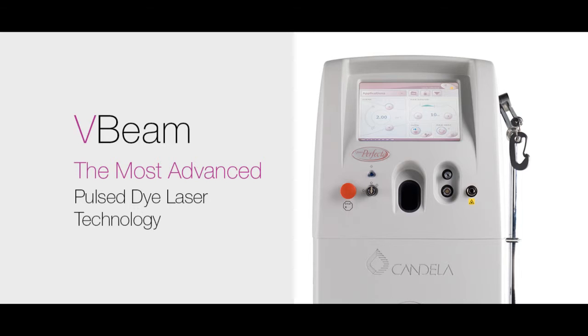A later study, however, failed to show significant improvement in facial acne using the same device, though the study included a large number of dropouts, potentially introducing type 2 errors. 2 recent studies showed that the improvement following PDL treatment is similar to that achieved with a chemical peel or topical preparations. Currently available PDLs usually operate in the 585–595 nm range and may or may not include cooling mechanisms. Mechanism of action.